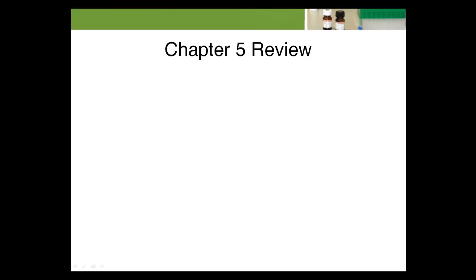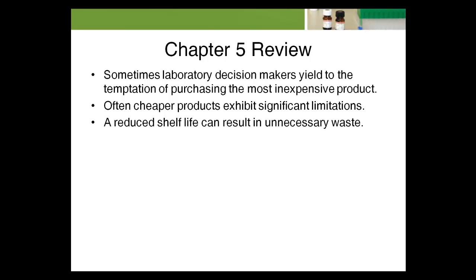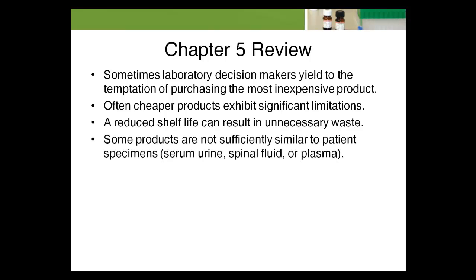We've reached the end of this module. Let's review some basic points. Sometimes laboratory decision makers yield to the temptation of purchasing the most inexpensive product. Often cheaper products exhibit significant limitations. A reduced shelf life can result in unnecessary waste. Some products are not sufficiently similar to patient specimens, serum, urine, spinal fluid, or plasma.